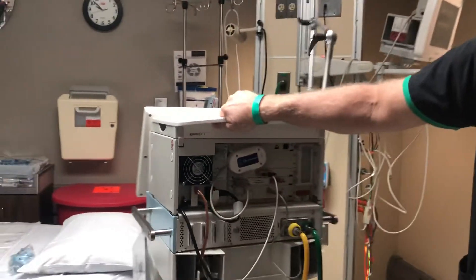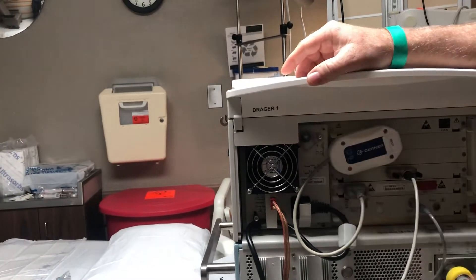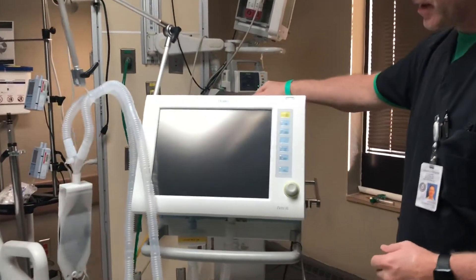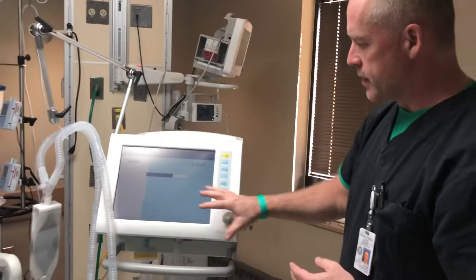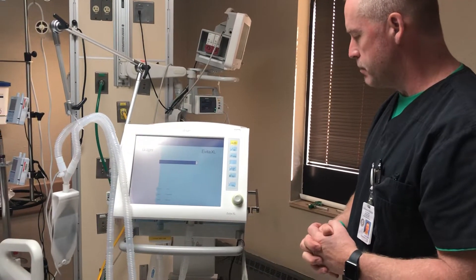Here in the very back of the ventilator itself is the on and off switch. We'll go ahead and turn it on. It'll alarm a little bit. It does a quick self-test, running through all the screenshots and also the lights for the other buttons as well.